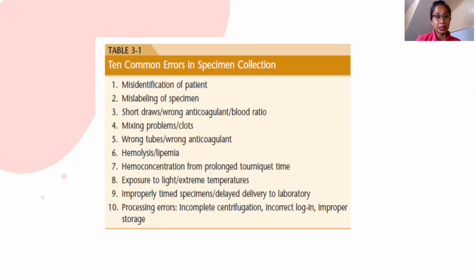So as much as possible, we want to prevent this one. Number one, top one class, misidentification of patients. So ang rami ng medtech class na nagkakamali dahil sa misidentification of specimen. Identification of patients. Example is yun, just asking the last name. So you're going to ask someone, ikaw po ba si Miss De La Cruz, ganyan, or Mrs. De La Cruz, ganyan. And nag-yes naman yung isa, hindi natin alam yung nanay pala, 'di ba? Mrs. De La Cruz rin siya. So mga ganung bagay, guys.